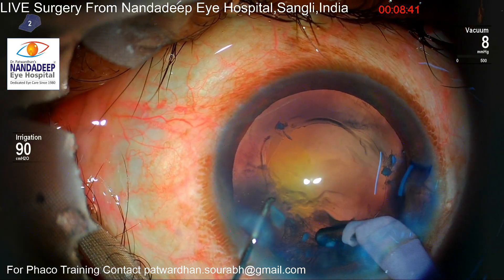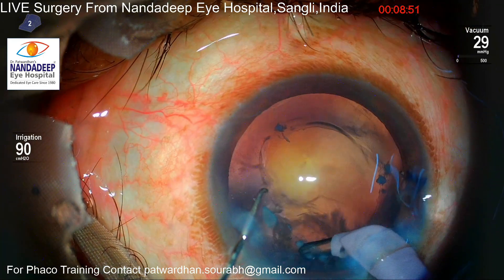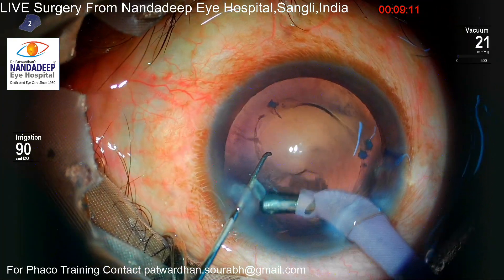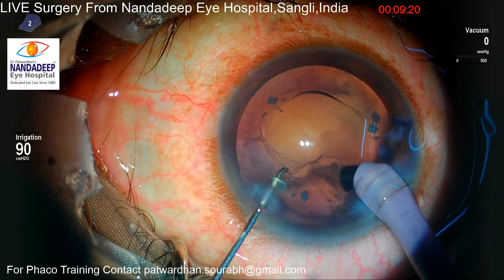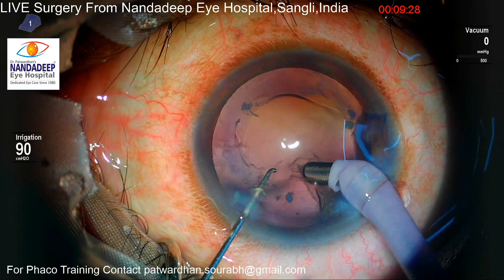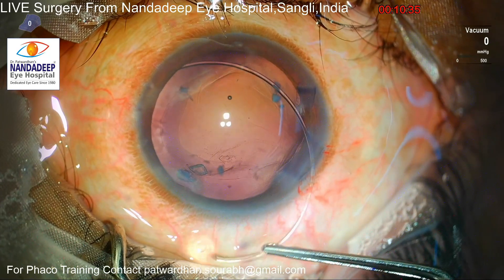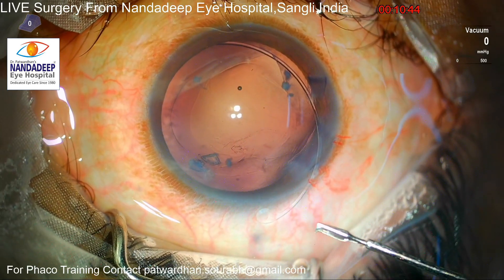Sometimes during cortex aspiration we might catch hold of the bag because the zonules are weak in that area. So I am very observant here, not using very high aspiration — just very gentle aspiration under the cortex. Using the foot switch control to have lower vacuum underneath the anterior capsule, and trying to engage and disengage those cortical fibers under the anterior capsule and remove them slowly. There are some fibrotic plaques underneath the anterior capsule, but I don't touch them at present.